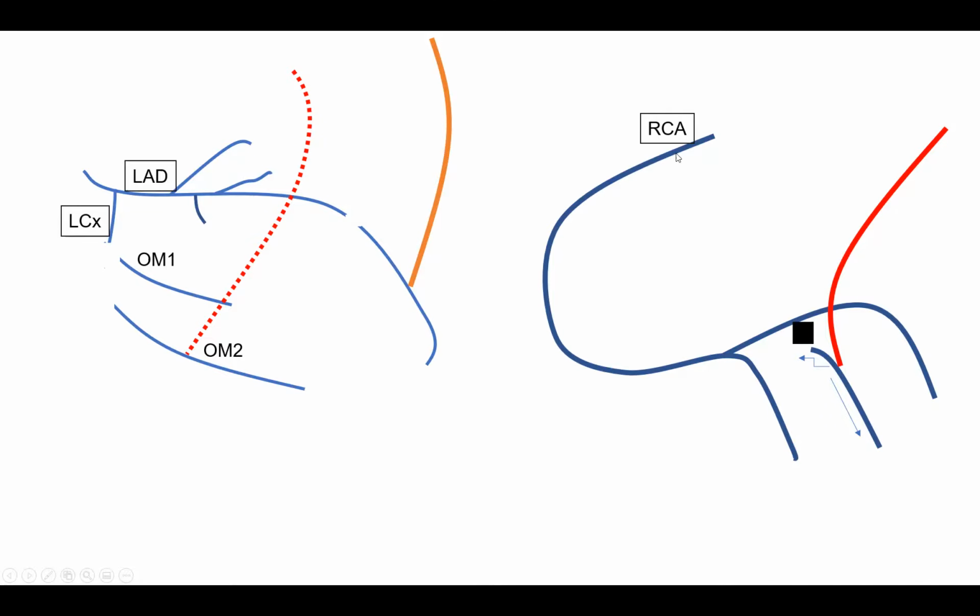If you had a 90% RCA stenosis, well, that could be causing ischemia, even though the graft to PDA is open. Frequently in those grafts to PDA, they do fill retrogradely. Frequently the disease on the right is somewhere here. So the graft to PDA fills retrogradely, not just the PDA, it fills retrogradely the PLBs. Not in his case, but luckily for him, the native right is open.